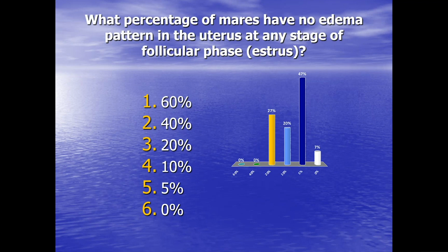But there's maybe a trace of luteal tissue. So when I have a mare where the follicle is growing, 25, 28 the next day, 31 the next day, but no edema pattern in the uterus. Cervix, I think it's opening, a bit hard to tell.